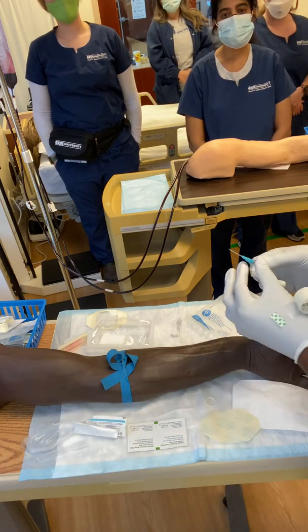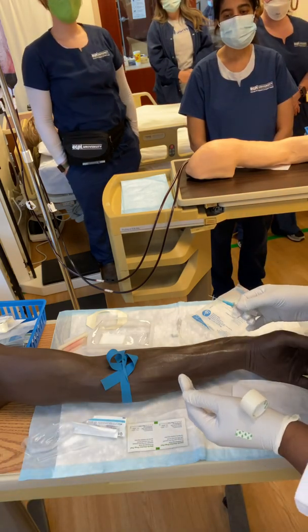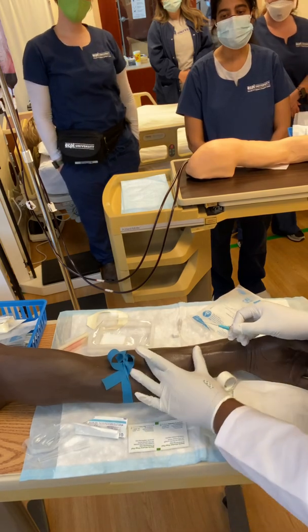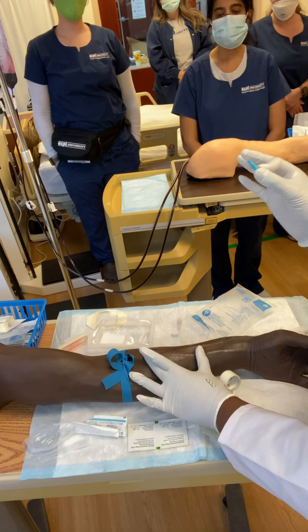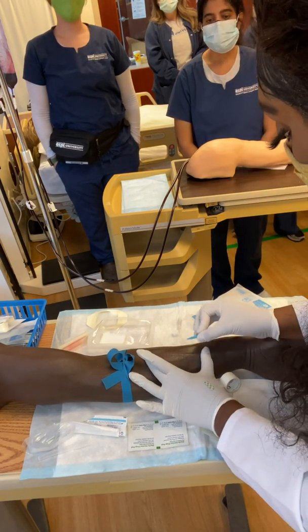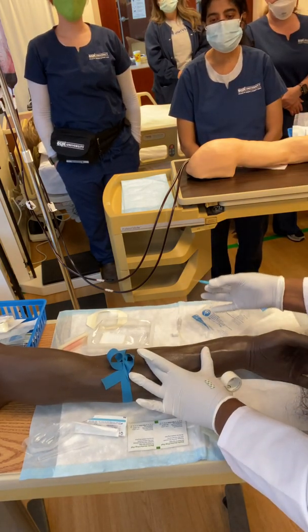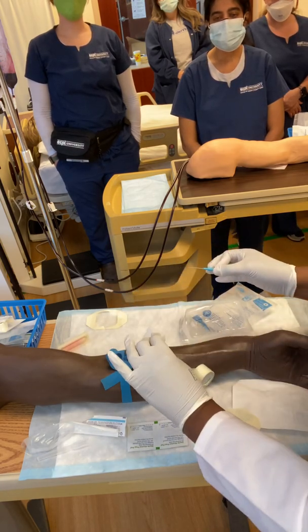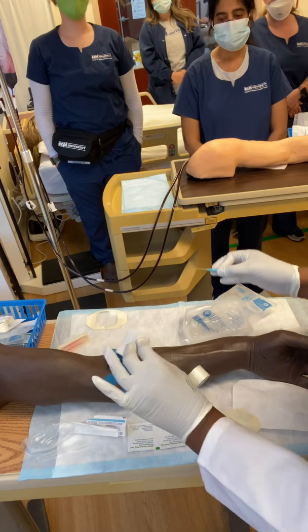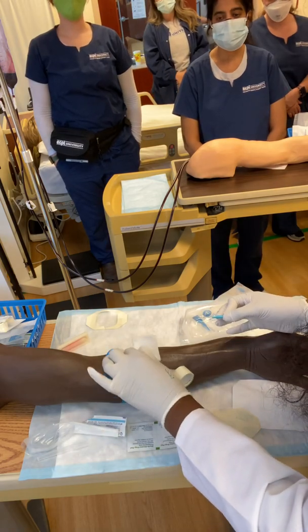All right, so we want to make sure when we access the site, we're going to pull the skin taut. We're going to make sure that our IV is bevel up. Okay, bevel up. And then when we do it, we want to make sure we have everything ready and handy. I like to have my gauze right here because sometimes that could be a bleeder. Then you've got blood all over the place, okay? So I need to put it right up here.